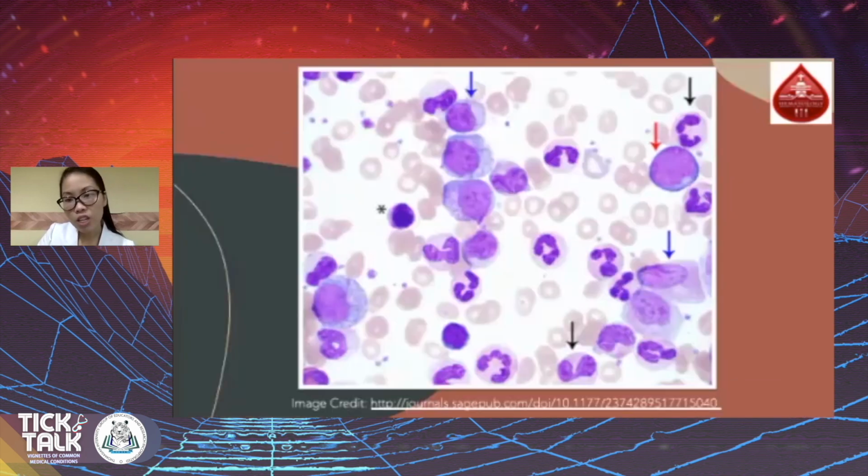In cases like this, we have to establish or confirm the presence of immature white cells in the PBS, especially in patients with unexplained leukocytosis. WBCs typically seen in the blood film include neutrophils, lymphocytes, monocytes, eosinophils, and basophils. Immature granulocytes from blasts to metamyelocytes in the PBS are abnormal findings.